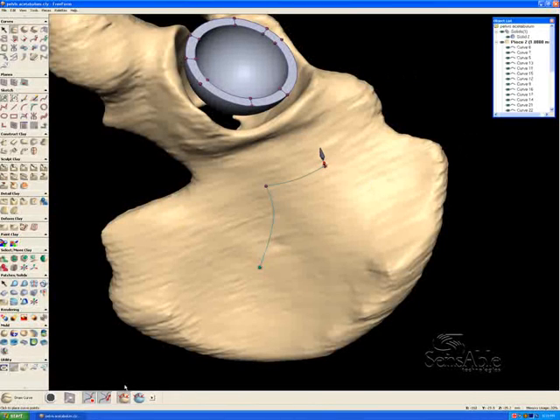And all I really want to do is make, if you imagine the end of the tab, where it actually makes contact with the pelvis, that's what I'm drawing out here. And so I'm haptically snapping. I get that physical snap into those edit points, so it's really fast to know when the curves are touching each other and lined up.